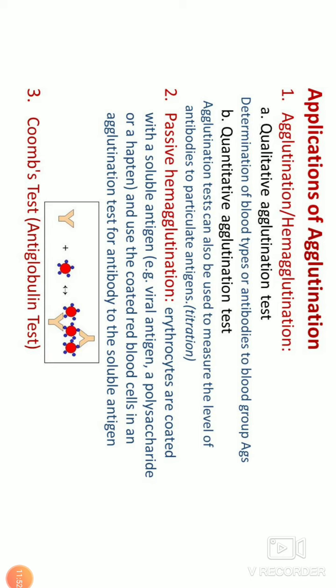Erythrocytes interact with antibodies, but agglutination may not always be seen. This could be due to deviation from the optimal antigen-antibody ratio, that is the prozone, or the erythrocytes could be preventing cross-linking of cells. In order to detect the non-agglutinating antibodies on erythrocytes, a second antibody directed against the antibody attached to its respective epitope on the erythrocyte is added. The anti-immunoglobulin can now cross-link the erythrocytes and result in agglutination. This test is known as the Coombs test or anti-immunoglobulin test.